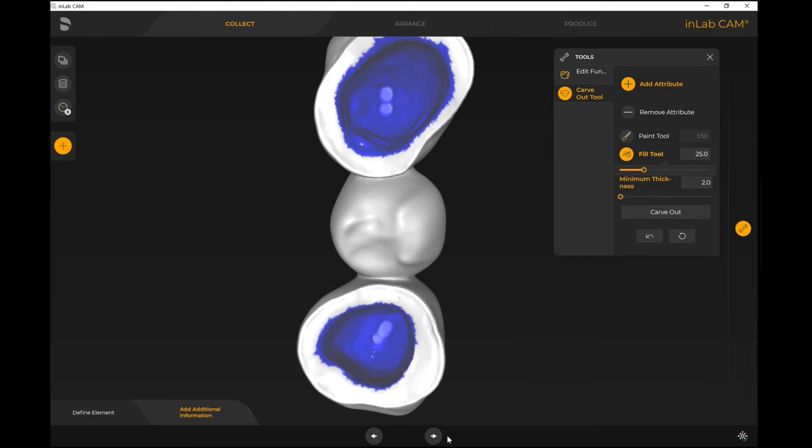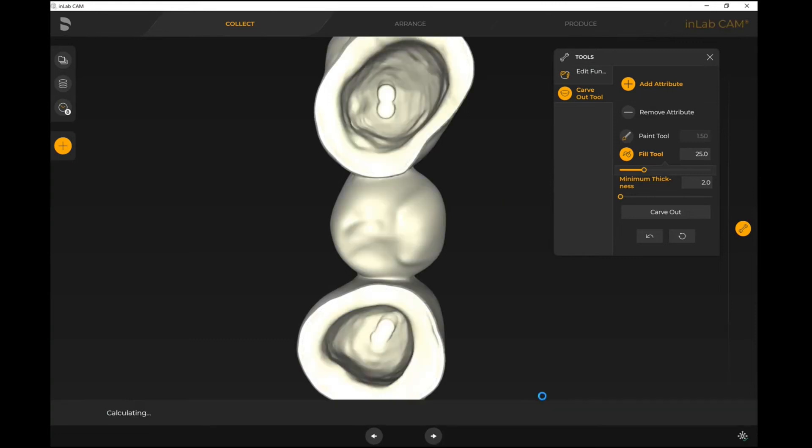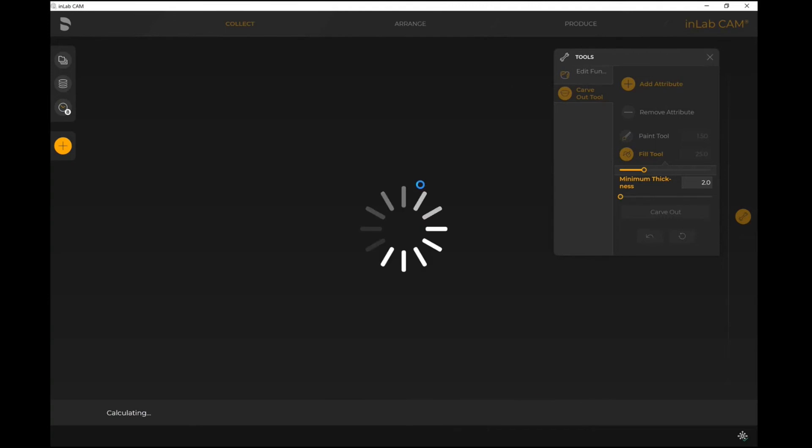And then I'm able to proceed forward. So that's the additional information that I can provide to the system in terms of what's needed for an STL file.